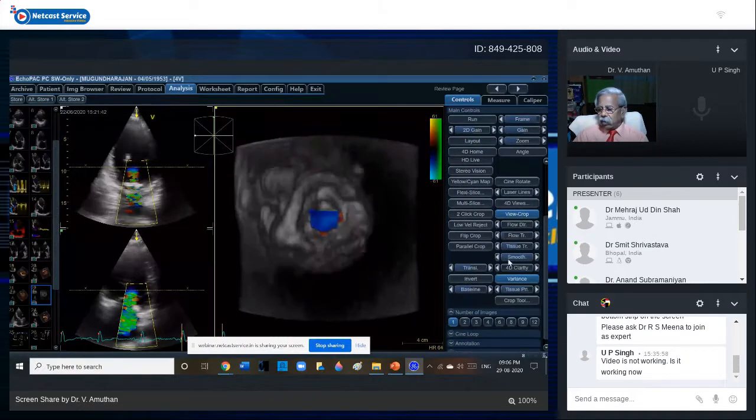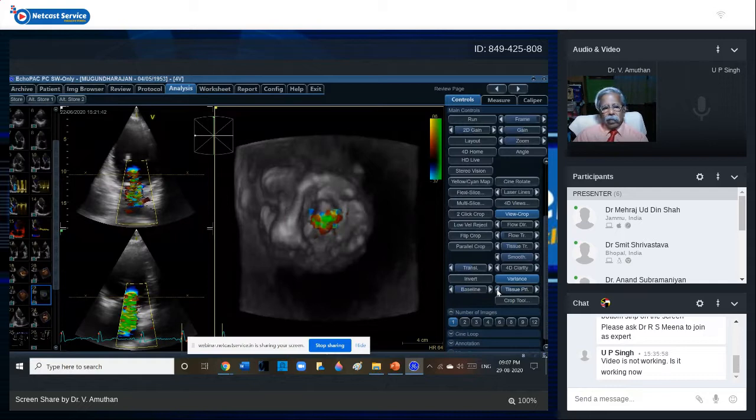And then you have to reduce the baseline. You see that the baseline has to be reduced to 37%, 32, 33 to 37. This has to be reduced first. Then the transverse line can be reduced to the neck. You can see here, this is the neck, and you have to place it exactly at the vena contracta. This is the vena contracta. And the tissue can be removed. See that tissue? I'm removing the tissue. Just like that.